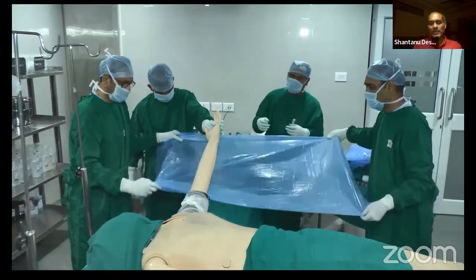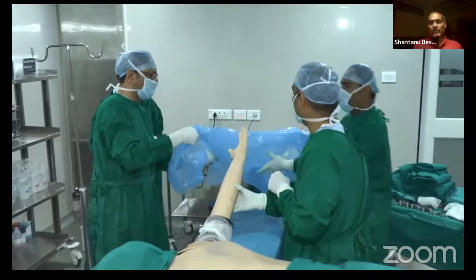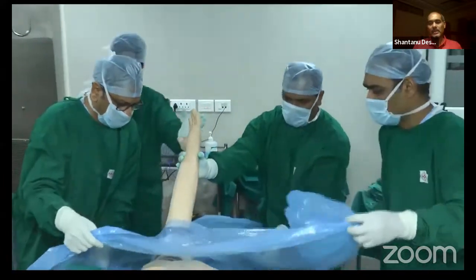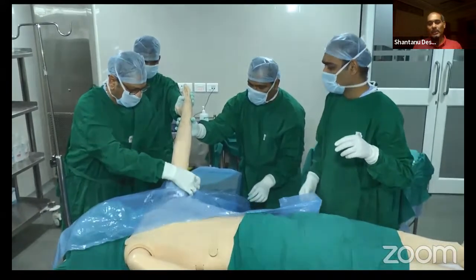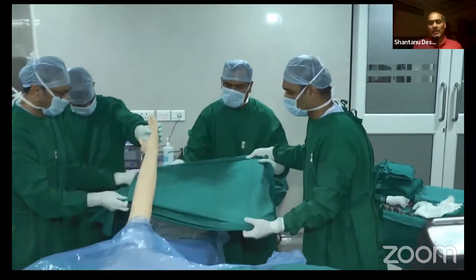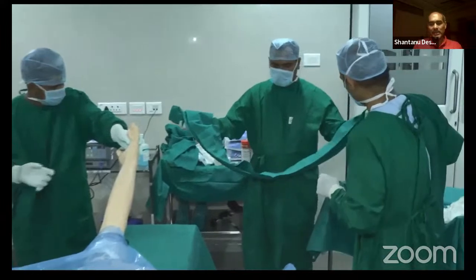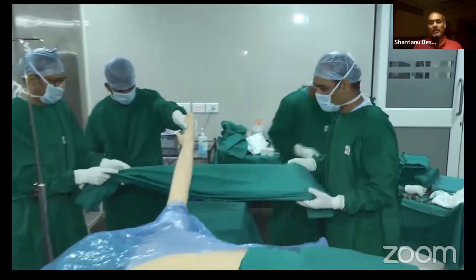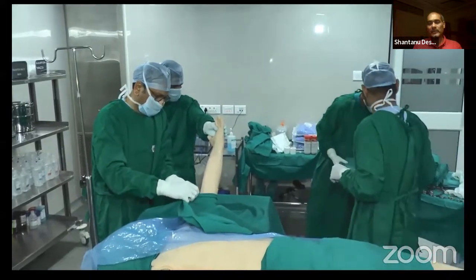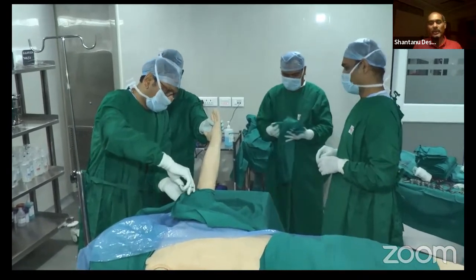First, a plastic sheet is put onto the hand trolley. A second plastic sheet is taken now, and a small cut is made in it, and that sheet is now taken up to the tourniquet, making sure you seal that area of the tourniquet. The drapes are used. The first drape goes on to the sterile plastic drape. The second bigger or longer drape comes, but the proximal ends are being circumferentially turned along the edge of the tourniquet and held secure with the towel clip.